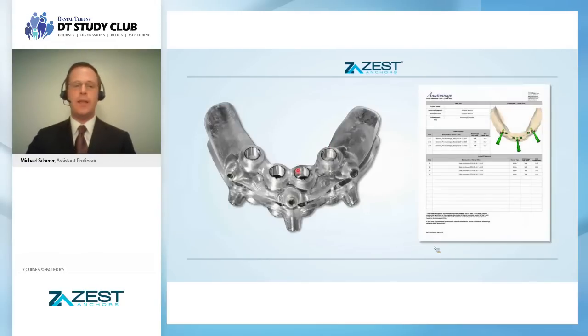So now at this point, we can then receive our computerized surgical guide that looks something like this. And I do tend to prefer to use anchor pins in this case. They're not compulsory. If you in your own practice are comfortable without using anchor pins, that's totally up to your clinical discretion. Also, the company is calibrated with the Zest LODI guided surgery methodology.